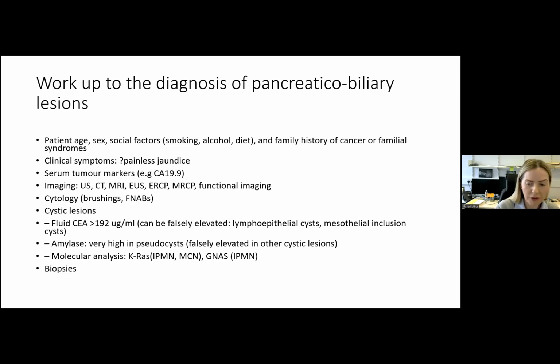And then, once I've had all that information, I now go into the cytology and I'm able to assess, considering all the clinical and imaging information that's been provided. The other thing to bear in mind is that because of the cytology, we're also at the advantage that we've got extra material which we can send off for ancillary testing.